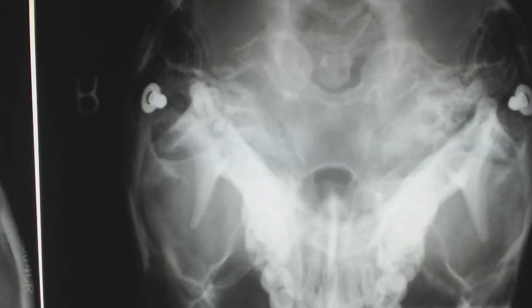The base posterior is the only x-ray in the Blair series where we want to take out their natural head carriage. Why is that important? If you have big head tilt in the image and you mark the base posterior convergence angles, you're going to get that information. Obviously, this work is all about precision.